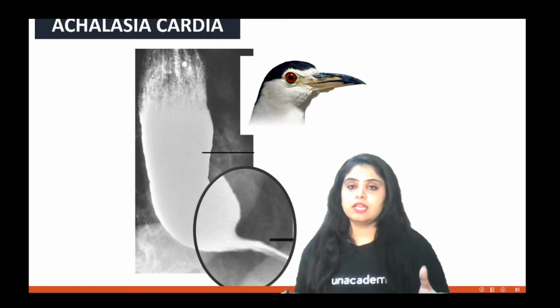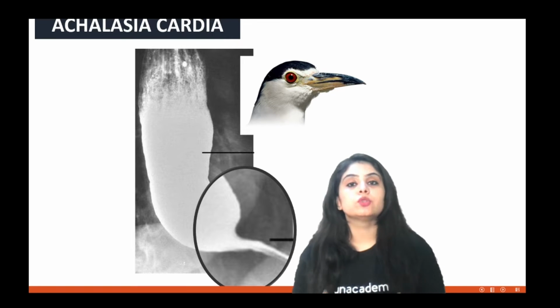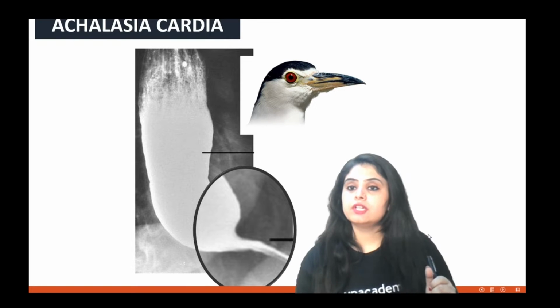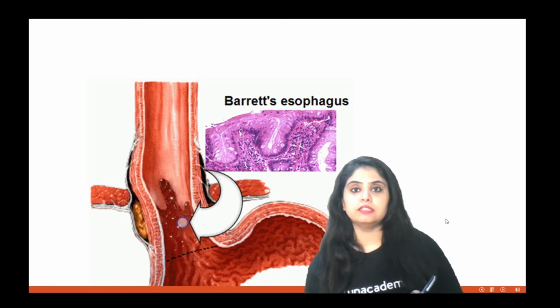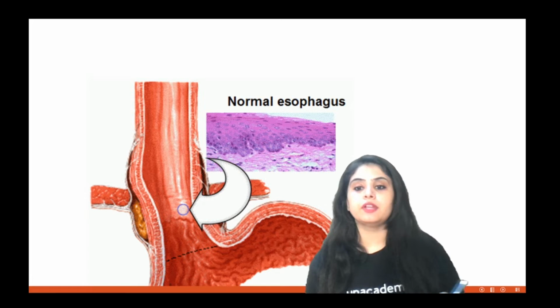This is the image that you get most commonly. Let's go on to the next picture. The next picture is a very famous one, which all of you know, where one epithelium of the esophagus is going to change into another epithelium.